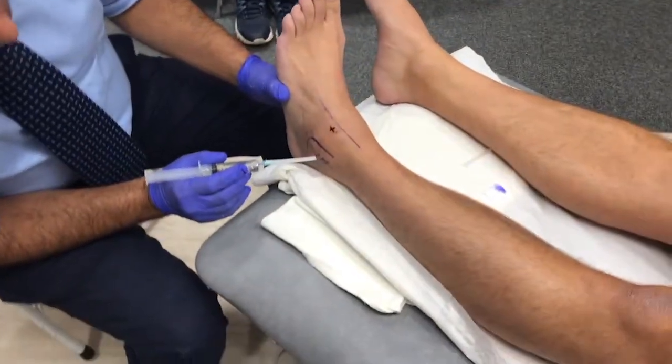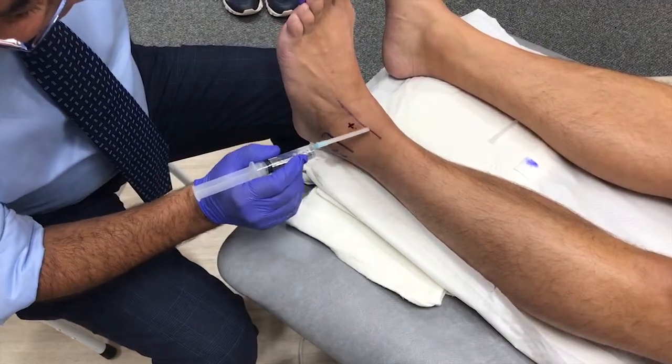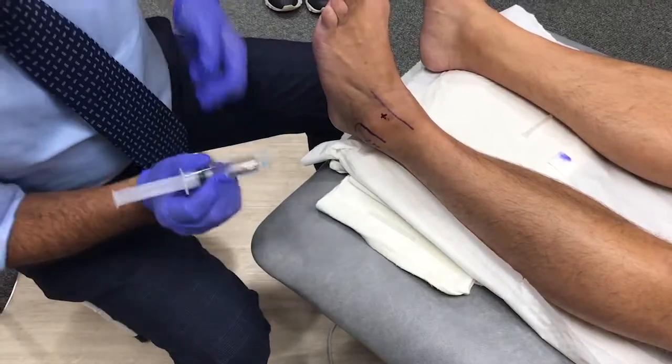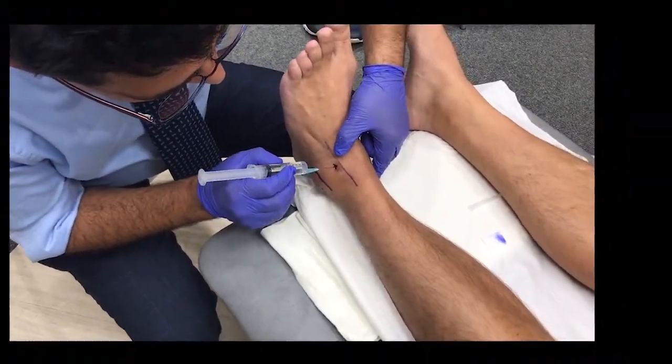Landmarks for the injection are the lateral malleolus, the extensor digitorum longus tendon, and the soft area just lateral to the extensor digitorum longus, as shown here by the cross.